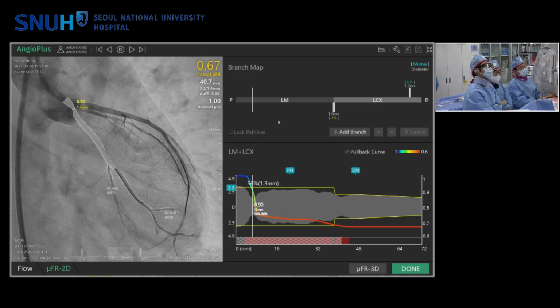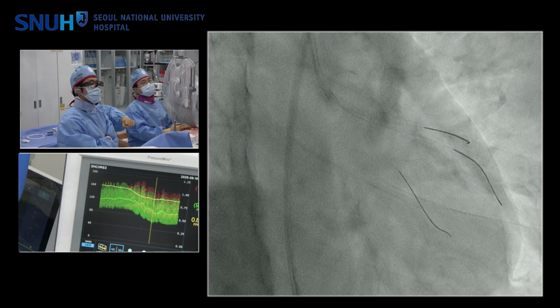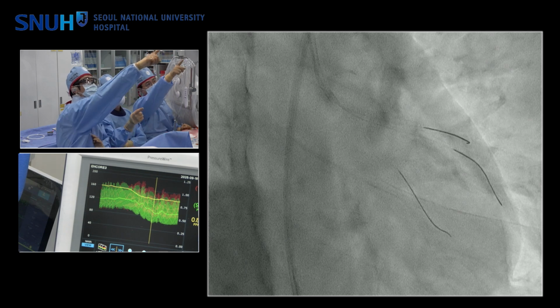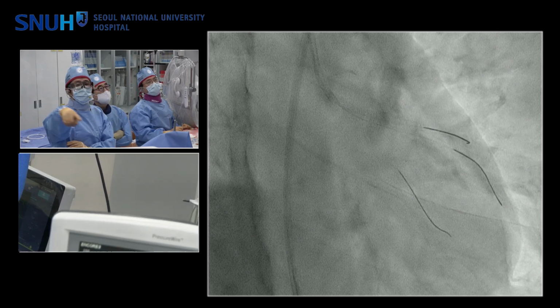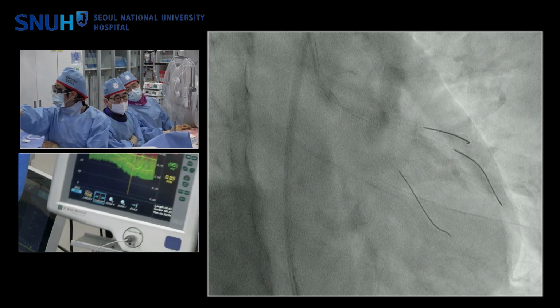한번 보자. FFR 한번 보여주지. 카메라. 카메라 넘겨줄 수 있나요? FFR 비춰주라고 카메라. 근데 화면이 저쪽에 안 나오고 있어요. 오케이. 우리가 안 보이잖아. 그 카메라 앵글이 안 보여줘요. 해줘야지. 아니. 얼마 더 나왔노 그래서? 요거 카메라 조정해야 돼요.